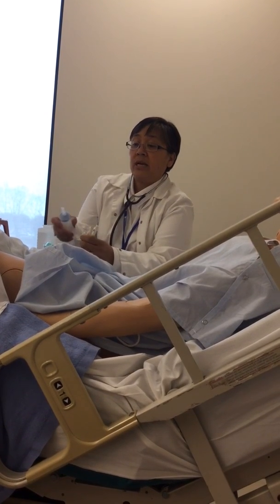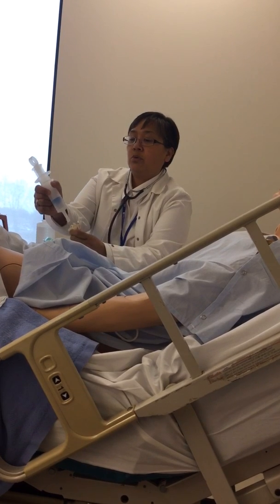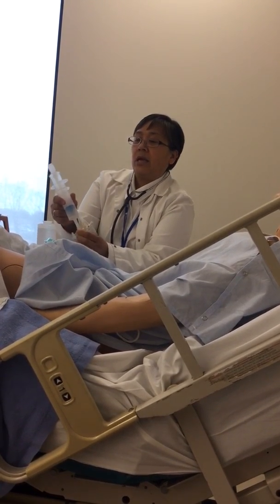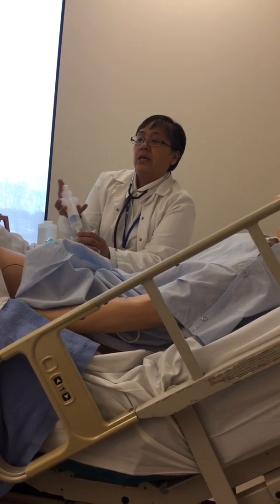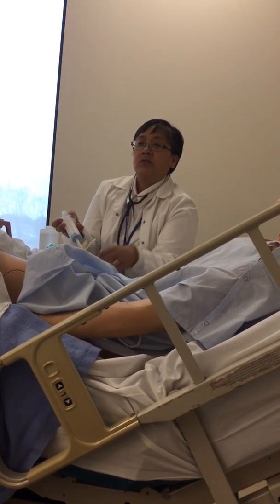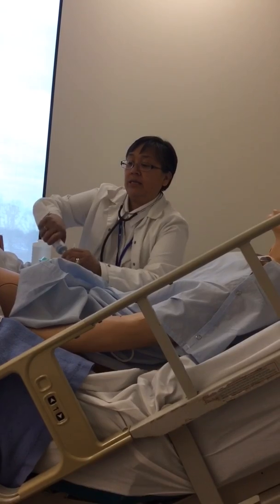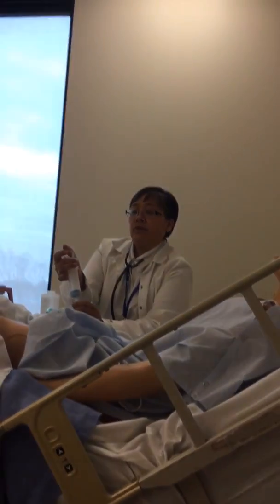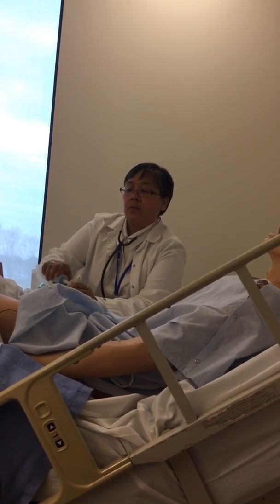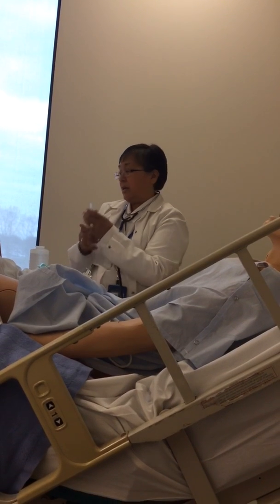And when you put this on here, okay, just think of it. If you don't securely push this on here, like I'm loosey-goosey and I've got it on, Janice, and I'm pushing the meds, you push it really hard, you're going to get that stuff all over your face. So make sure you push it on really tight, and when you're giving that residual back, push it in. Okay, so now I'm going to take this apart. Get ready for my medications.